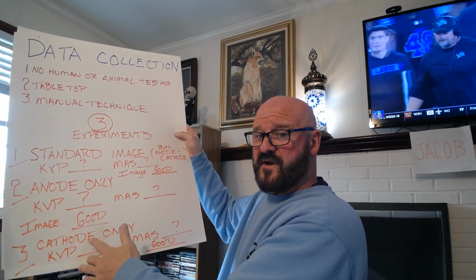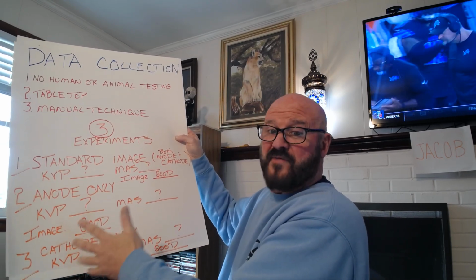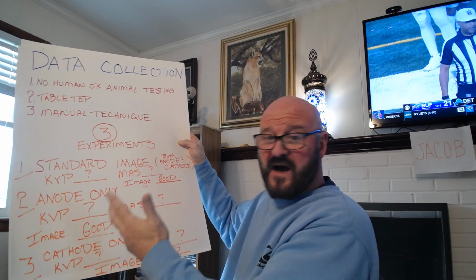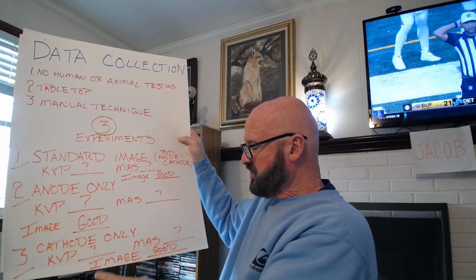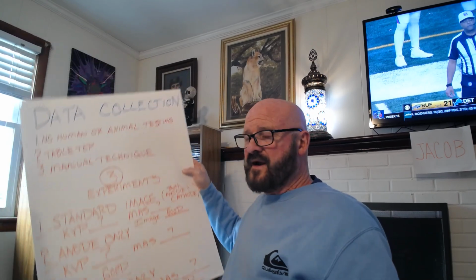So where are we? Are we at 100? That would be great. Or are we at 120? I don't know. But that would be the information that I would be looking for. And I would be uncomfortable, I don't know if the EI numbers that are going to appear on the screen are going to be reliable.